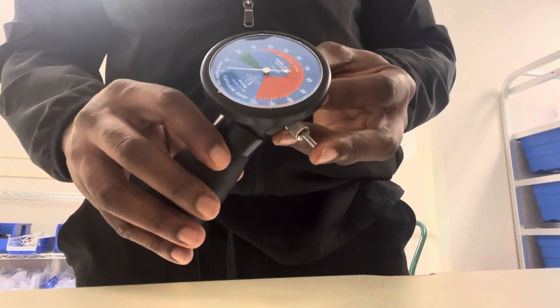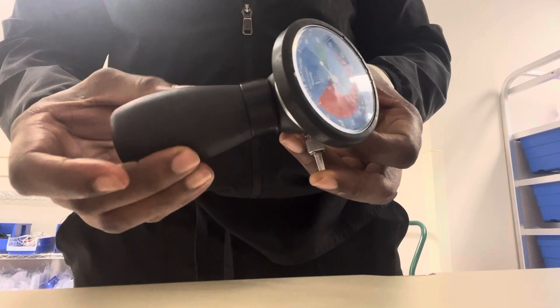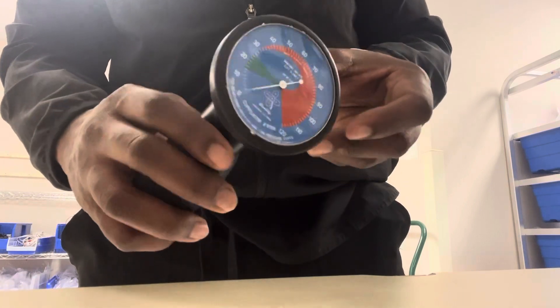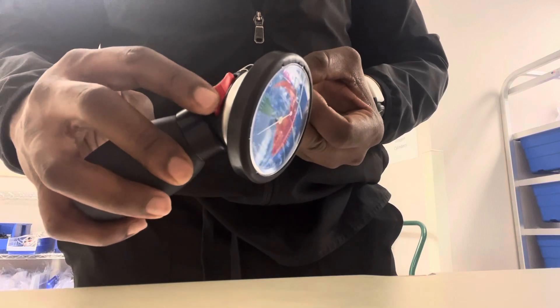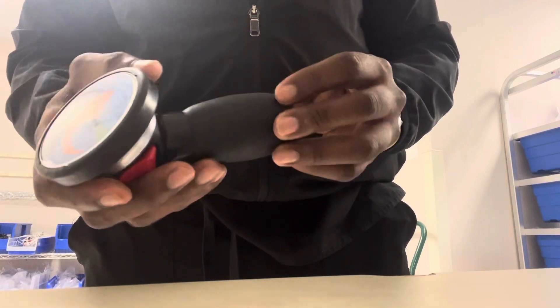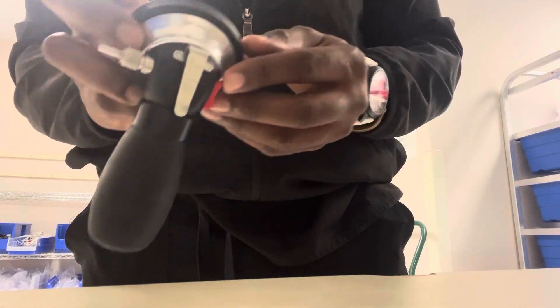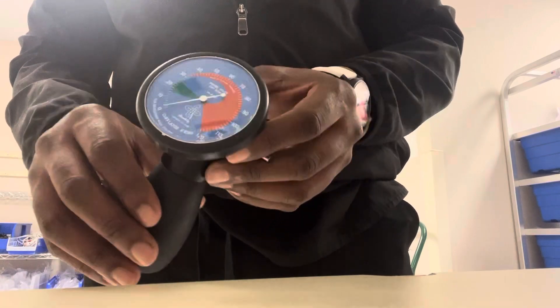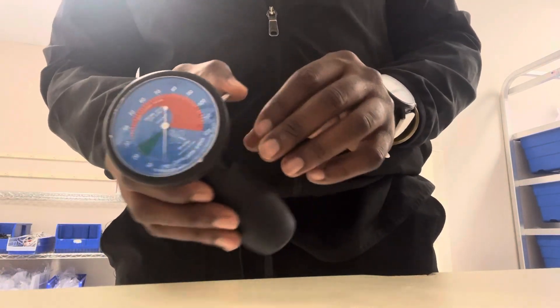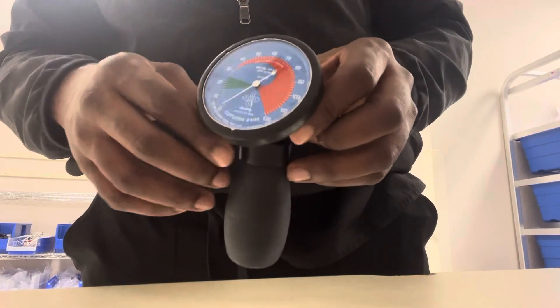You basically squeeze this part here to inflate the cuff, and you push this lever here to deflate the cuff. Some of them have a clip. This is a cuff-a-liter, but we have several different pressure cuff manometers and inflators and deflators — but this is the cuff-a-liter here.